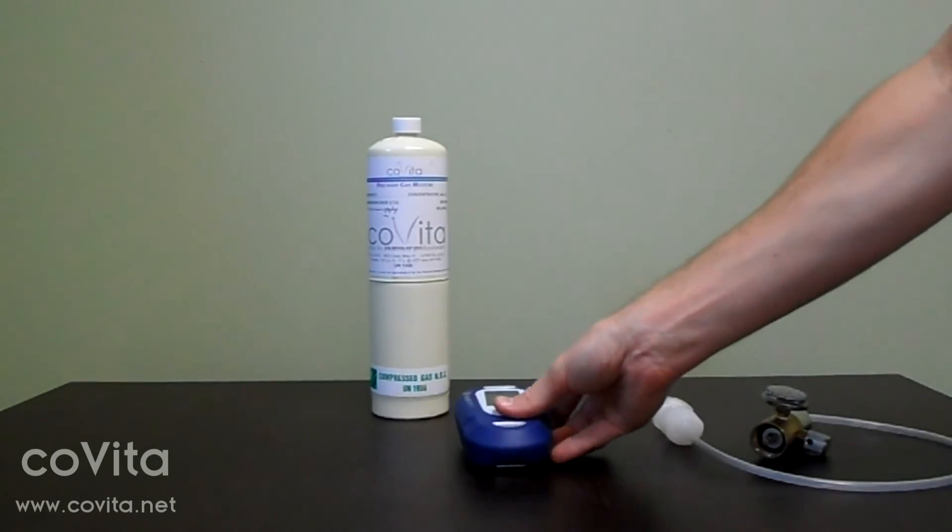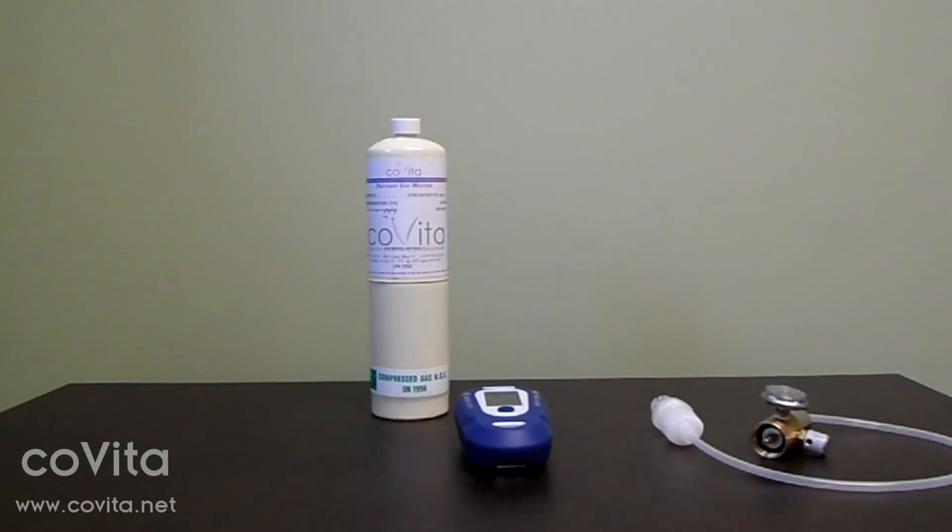Your calibration is now complete and you are now able to conduct a test or turn your monitor off if no further readings are necessary.